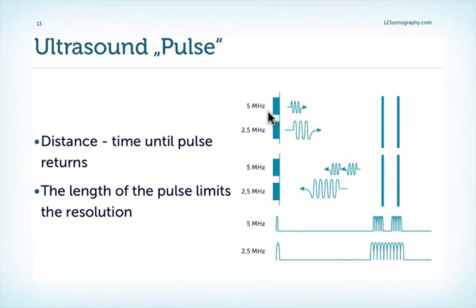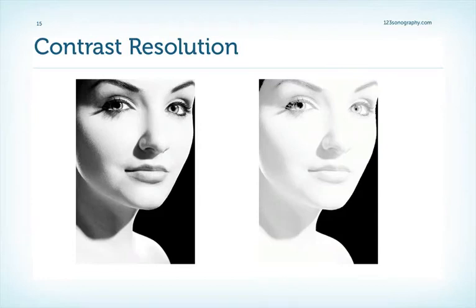And remember, the shorter the intervals between the pulses are, the more rapidly we can fire one beam after the other, and therefore we also enhance the lateral resolution. So you can already see that there's a very strong interplay between many different factors in ultrasound. The pulse width, the pulse frequency, the imaging frequency, the lateral resolution, the resolution altogether, and also, of course, the frame rate.